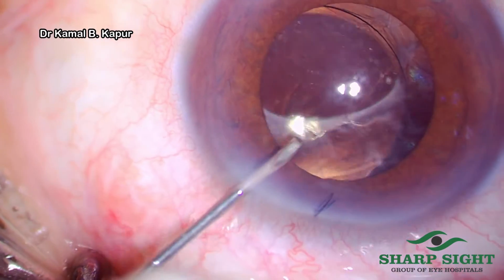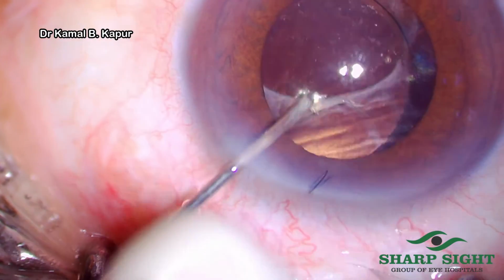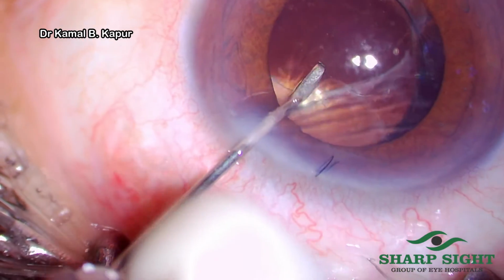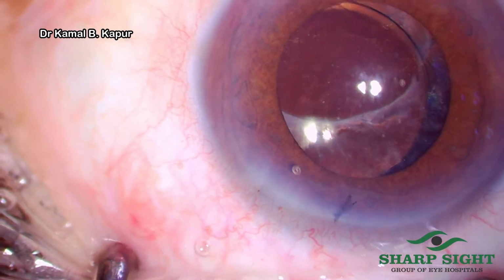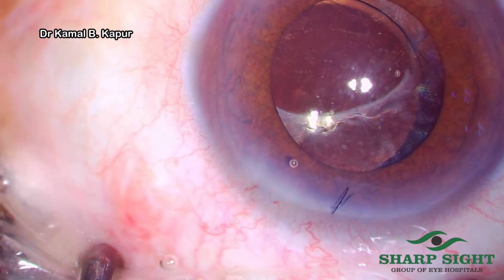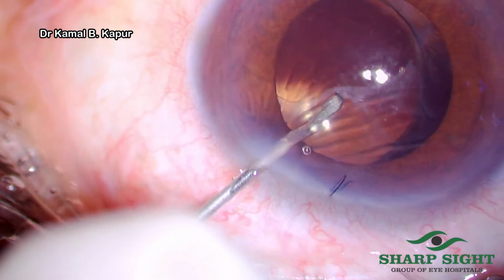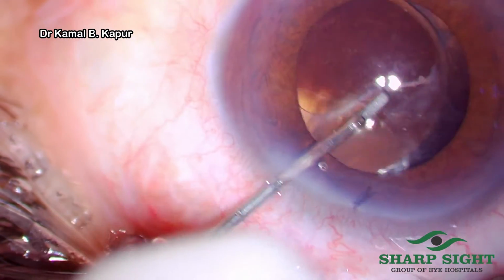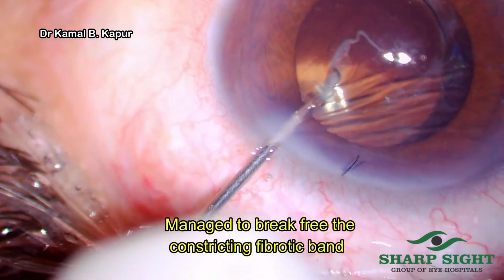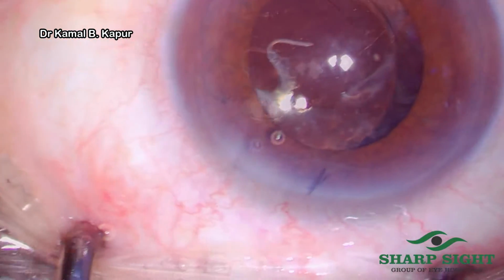So we start by breaking this fibrotic band in hope of releasing this constrictive force onto the lens, which is actually entrapping the lens and restricting it to come back to its position. By breaking away this fibrotic band, we create a little loose area there. Now we proceed to actually cut the anterior capsule, and there we realize that we have actually achieved what we wanted to. We have broken the fibrotic band, and with the sudden snap sign or breaking up of that, we will notice that the IOL has actually slightly snapped better into its position.